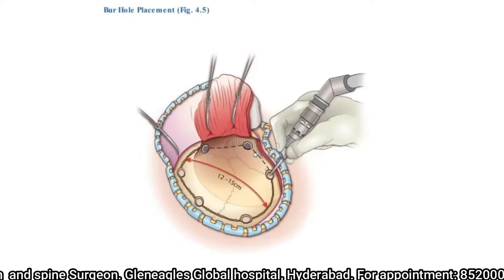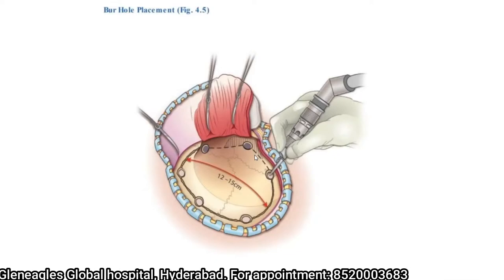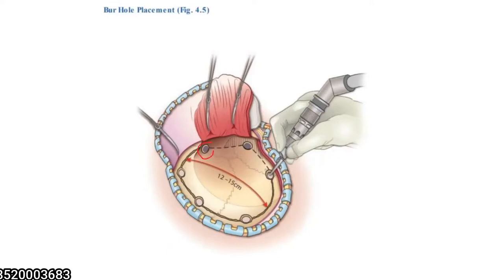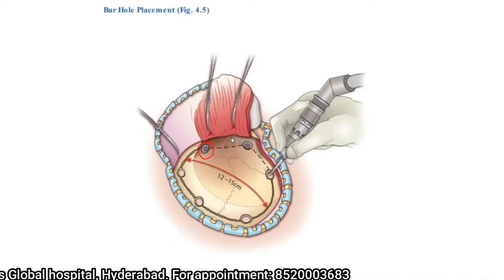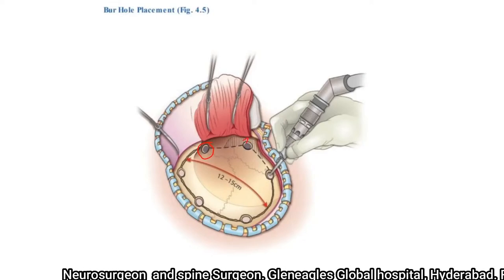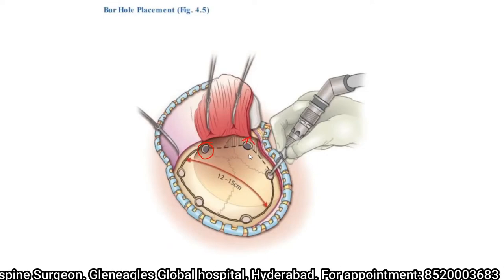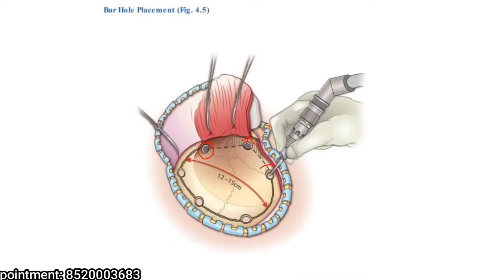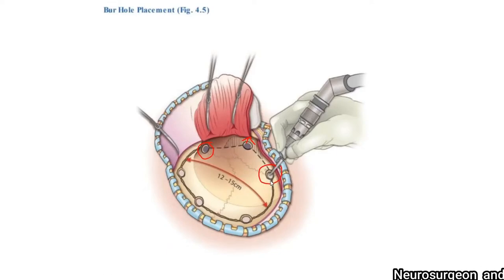We use a high-speed drill to place the burr holes so that the chances of penetrating the dura mater are less. The first burr hole is the classical key burr hole. The second is placed at the root of the zygoma, as low down as possible on the squamous temporal bone — the more towards the base of the skull, the easier it is to expose the middle cranial fossa. The third burr hole is above the mastoid; do not open the mastoid air cells. The remaining burr holes are placed along the frontoparietal region.